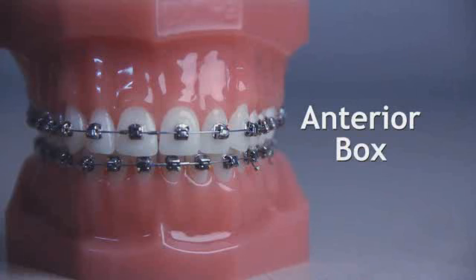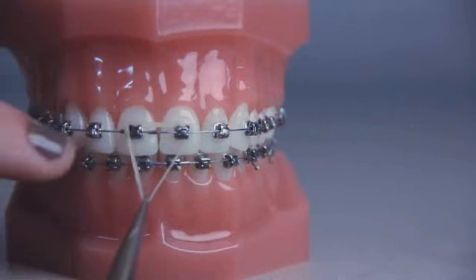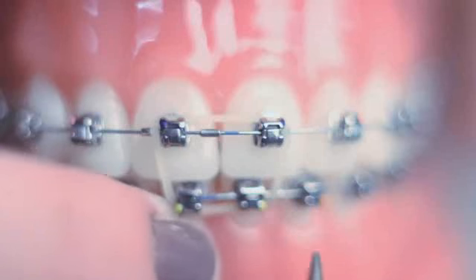Some patients have an anterior box. If you do, make a square with the rubber band around the center teeth on the top and around the center teeth on the bottom.